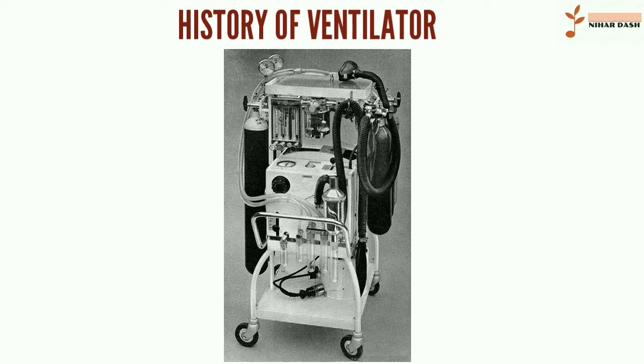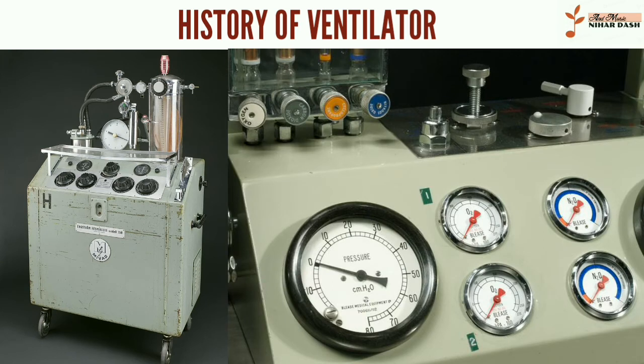Other forms of non-invasive ventilators, also used widely for polio patients, include biphasic cuirass ventilation, the rocking bed, and rather primitive positive pressure machines. In 1949, John Haven Emerson developed a mechanical assister for anesthesia with the cooperation of the anesthesia department at Harvard University.